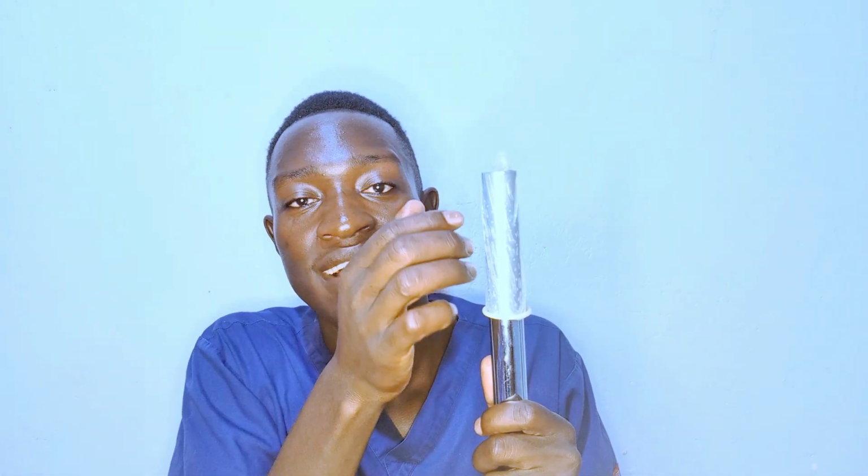While unwrapping, if you have a foreskin, if you are not circumcised, before unwrapping the condom you should pull the foreskin back a little bit. Then unwrap it towards the shaft of the penis.